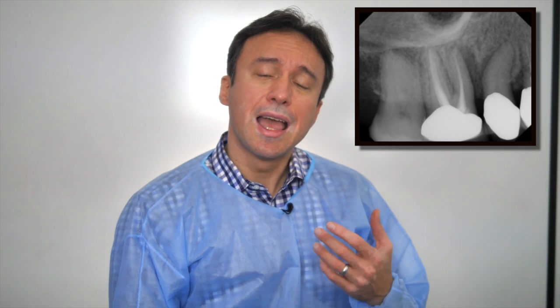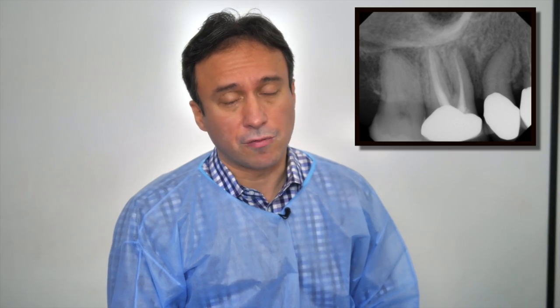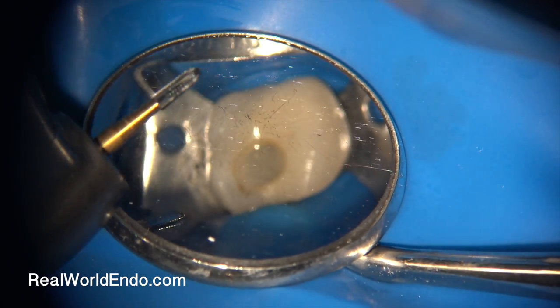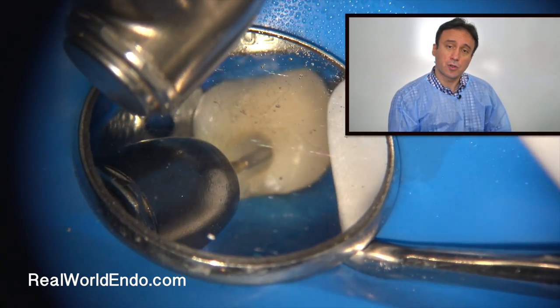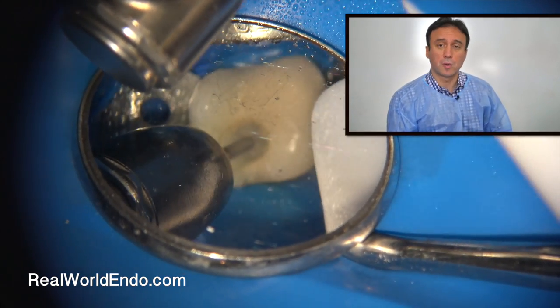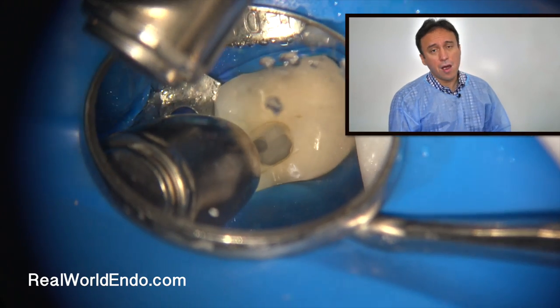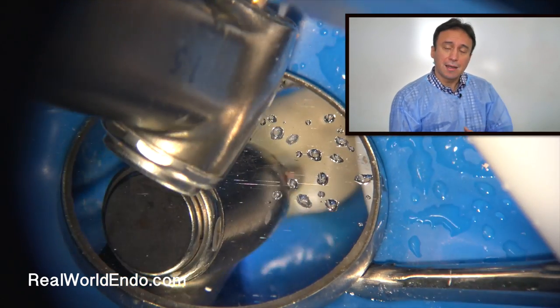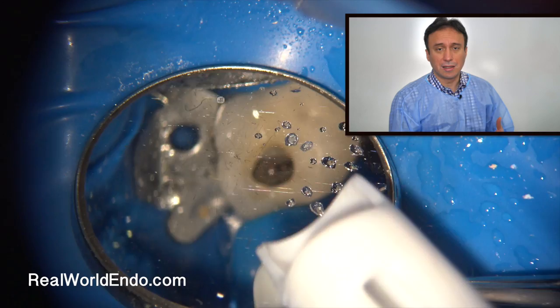Since the crack cannot be validated radiographically — either by regular x-ray or a CBCT — you need to judge the patient's level of motivation for saving their tooth to decide what's the best course of action for them. This patient was very motivated, and while deciding whether a non-surgical or a surgical approach was best, I chose a non-surgical approach since the access through the crown was previously made and was just filled with composite, and getting back into it had little risk.